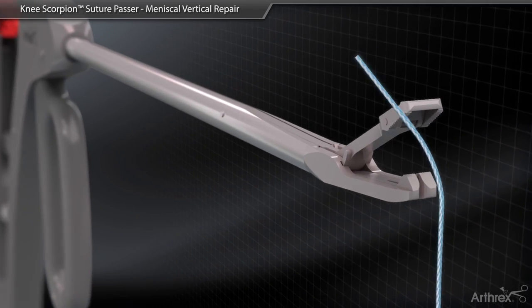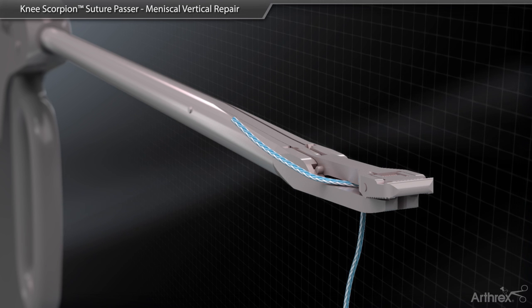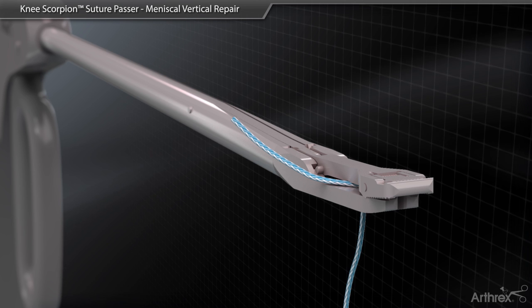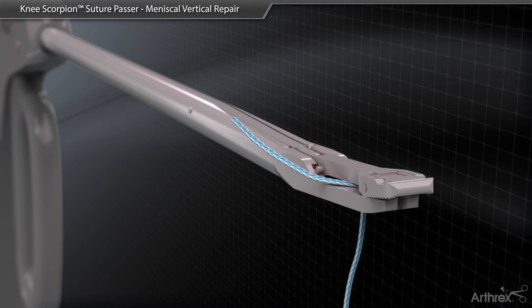Load the bottom jaw of the Knee Scorpion with either 0 or 2.0 fiber wire so that the suture is orientated to the right side of the needle with approximately a 1 inch tail of suture in an upward position.